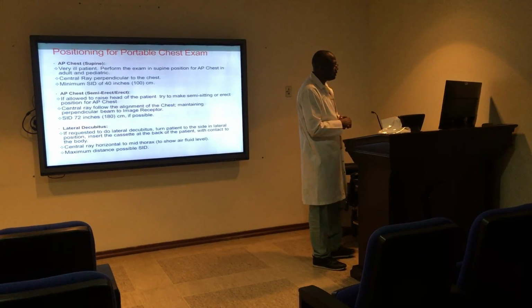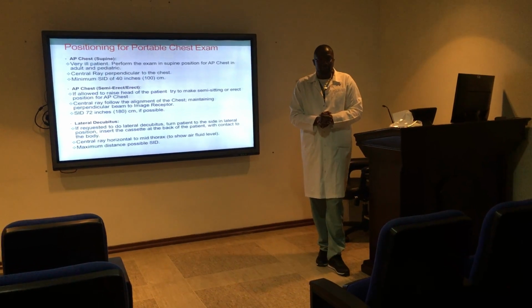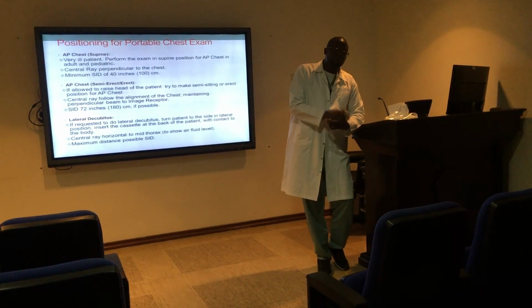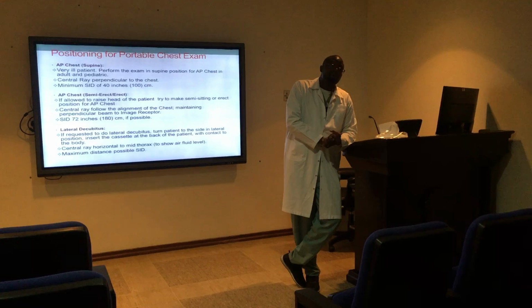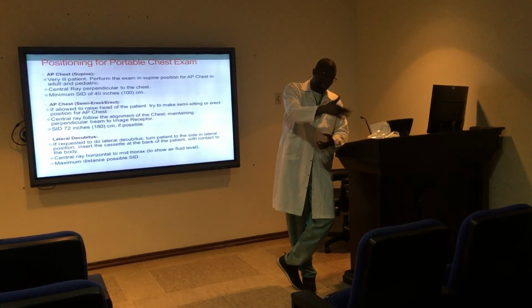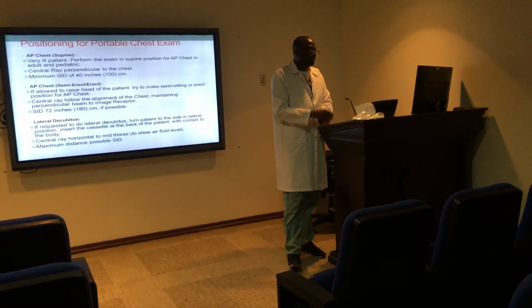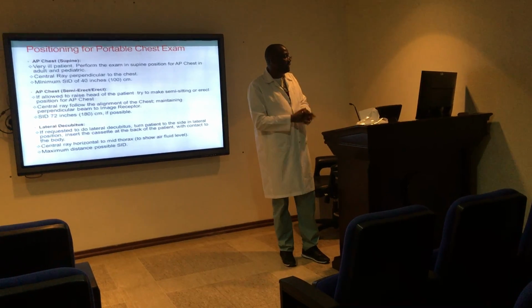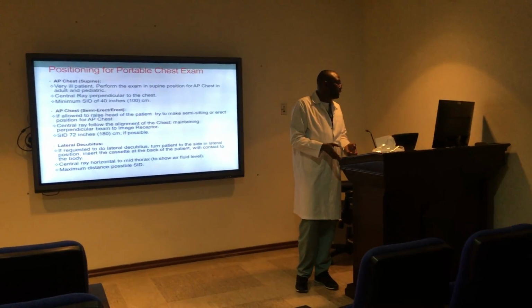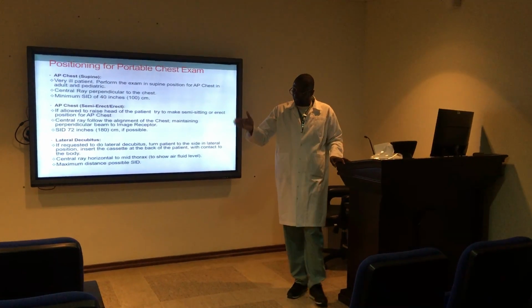The next one is the lateral decubitus. We all know lateral decubitus. The reason why the doctor might request this, you might not come across this most of the time, but I have to bring it into this class just for you to have an idea that sometimes when they request it, you have to turn the patient on the side.